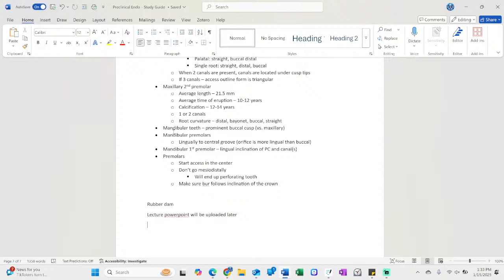They come in two sizes. Two, right? Only two. Yep. You don't want to use the small one. I don't know, maybe you use that in endo, but not for us. Unless you have a very tiny patient with a very small face and mouth, that's fine, because you don't want to cover the whole face. You want your patient to be able to breathe, right? But most of the time, just use the big size.